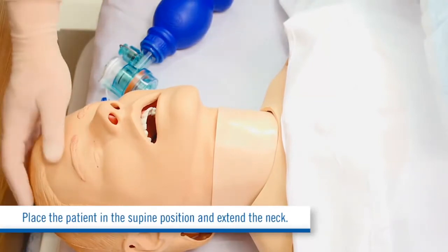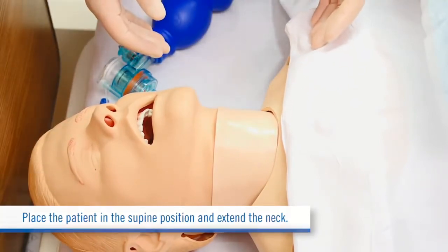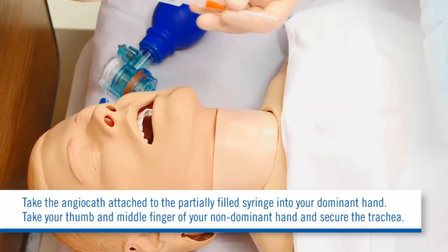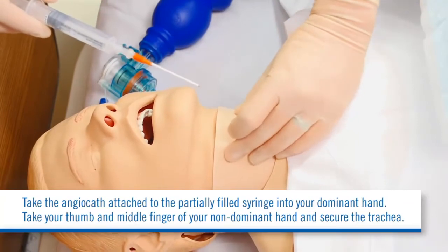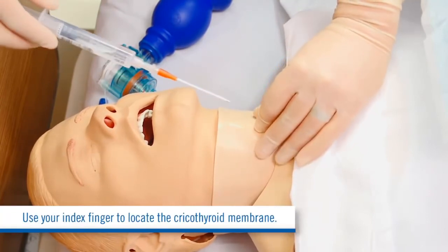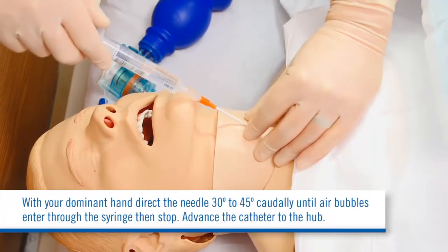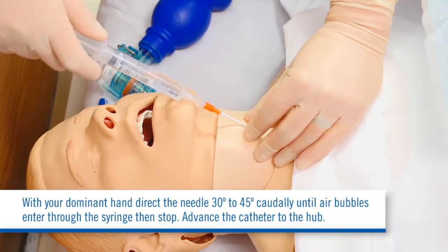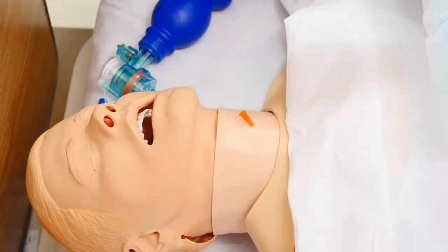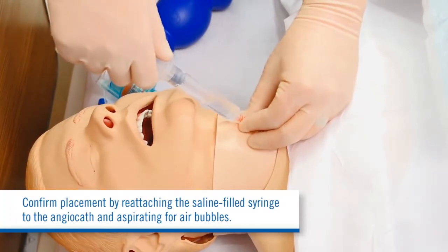Now to the procedure. Place the patient in the supine position and extend the neck. Prep and drape, gown and glove — don't forget your face mask. Take the angiocath attached to the partially filled syringe into your dominant hand. Take your thumb and middle finger of your non-dominant hand and secure the trachea. Use your index finger to locate the cricothyroid membrane. With your dominant hand, direct the needle 30 to 45 degrees caudally until air bubbles enter through the syringe. Stop. Advance the catheter to the hub. Confirm placement by reattaching the saline-filled syringe to the angiocath and aspirating for air bubbles.